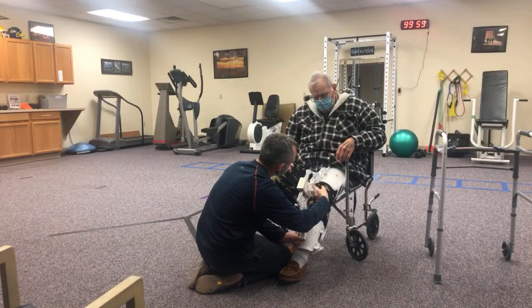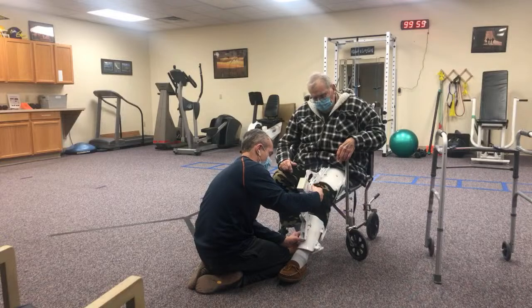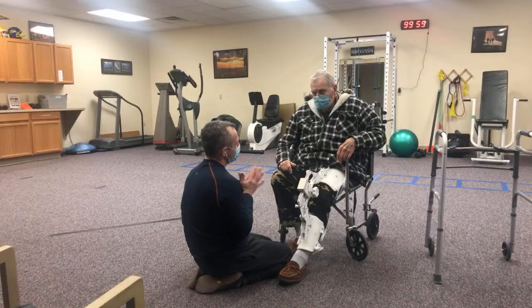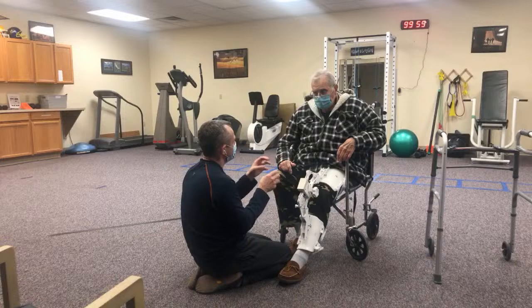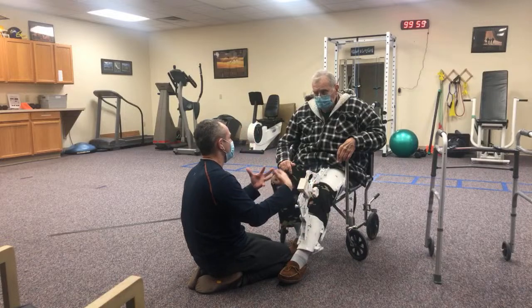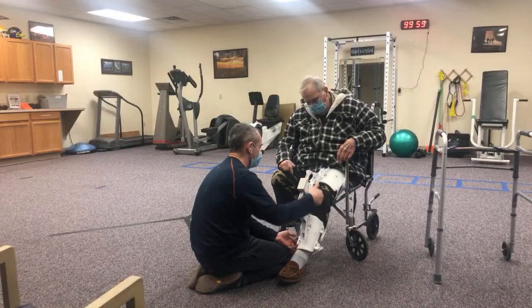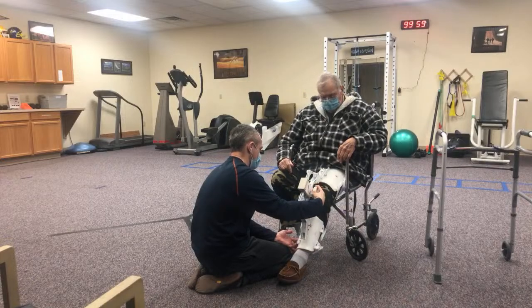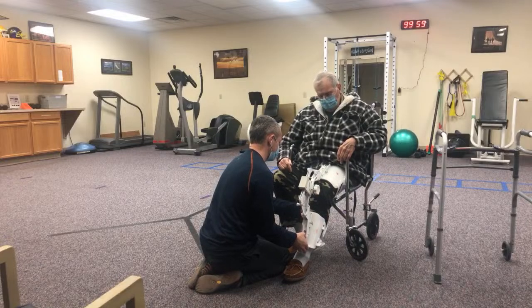I'm going to bring it to where you are right now. There's a little gauge here but I'm not too worried about that. I want you to feel a little pressure but I don't want you to feel pain, because I'm just getting an idea of where you're starting. This will also help us track progress as you're improving.